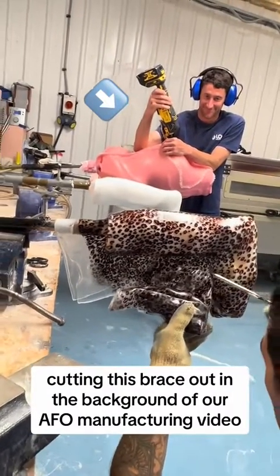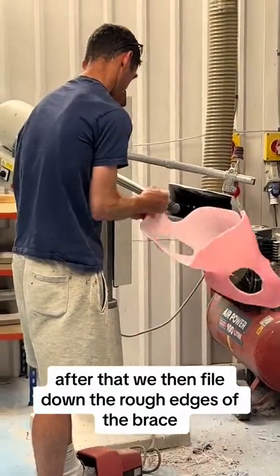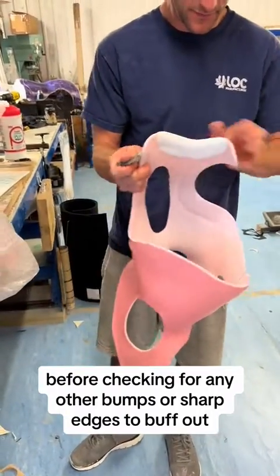Senior technician Joseph was actually cutting this brace out in the background of our AFO manufacturing video. After that, we file down the rough edges of the brace before checking for any other bumps or sharp edges to buff out.